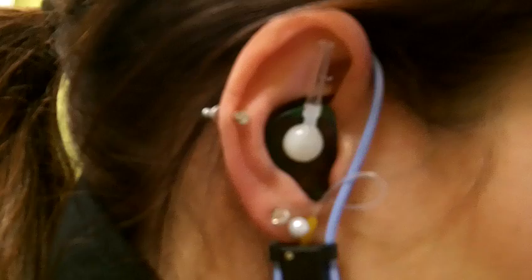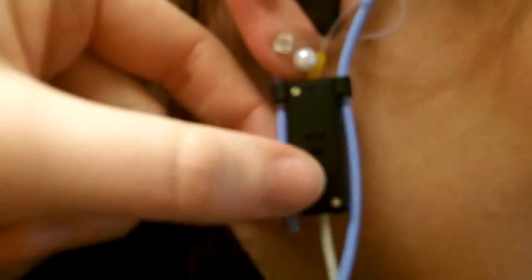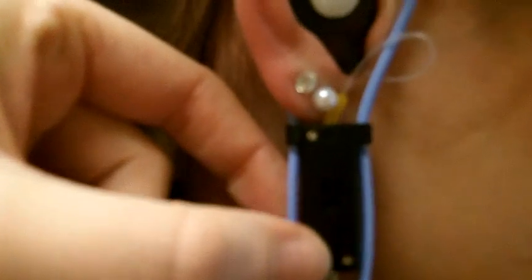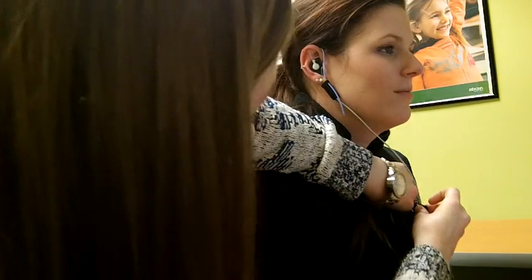So this is sort of our finished product. You have the probe tube going in. Another important thing is to make sure that the microphone is pointing outwards. Hope you can see that on there. Then you also want to make sure that this clip is kind of pulled tight and is hooked somewhere on the opposite side, just so it kind of holds it a little bit tight.